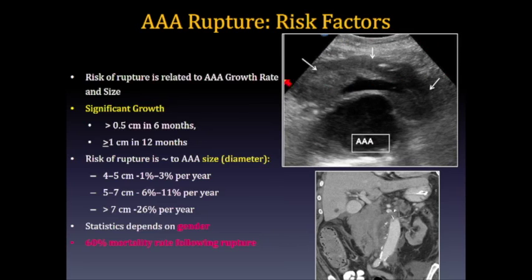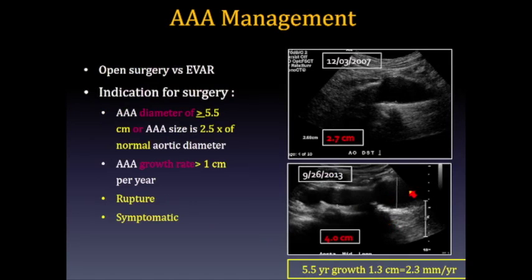And this is one of the images that shows an abdominal aortic aneurysm with a complex fluid enveloping the anterior abdominal aorta, and this is a hemorrhage from the rupture. And this is already a post-operative CT that demonstrates the same retroperitoneal hemorrhage associated with the ruptured aneurysm.